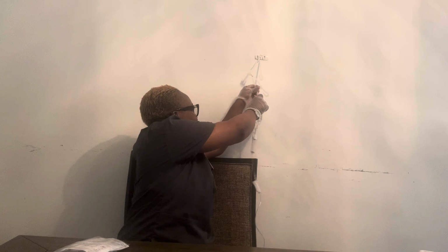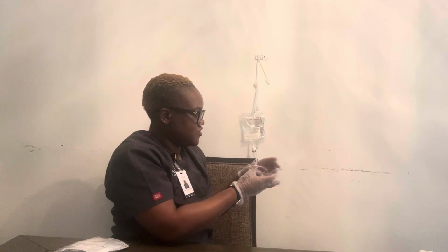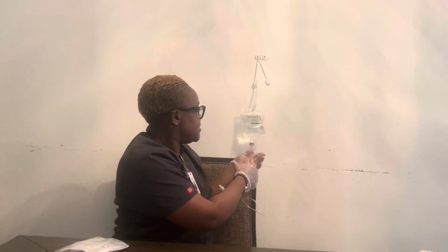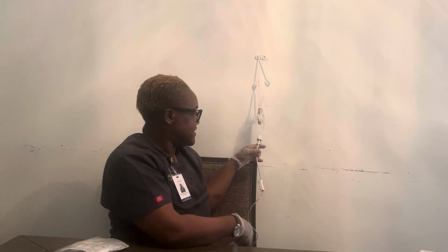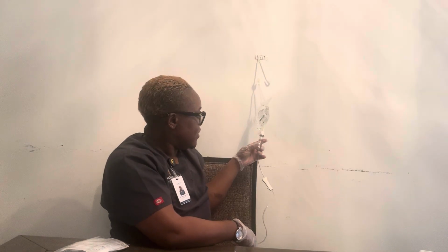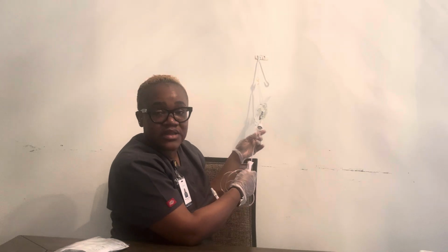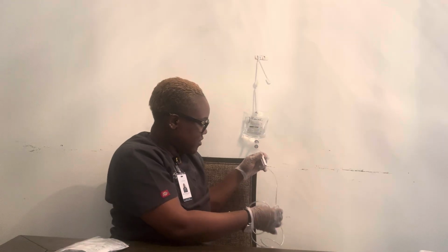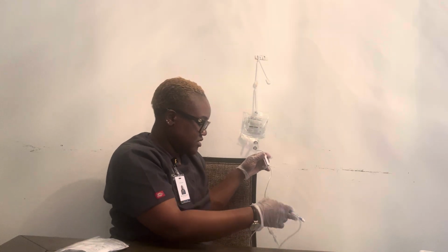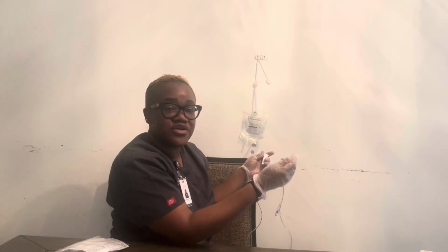I'm gonna hang this lower. Okay, so the next thing, I am gonna have to prime my line, and in order to prime my line, I'm gonna squeeze my drip chamber until it's half full. And now when it's half full, I am gonna slowly open my roller clamp, and then I'm gonna open it until the fluid runs all the way through the line. I have to ensure that there's no air bubble in it.